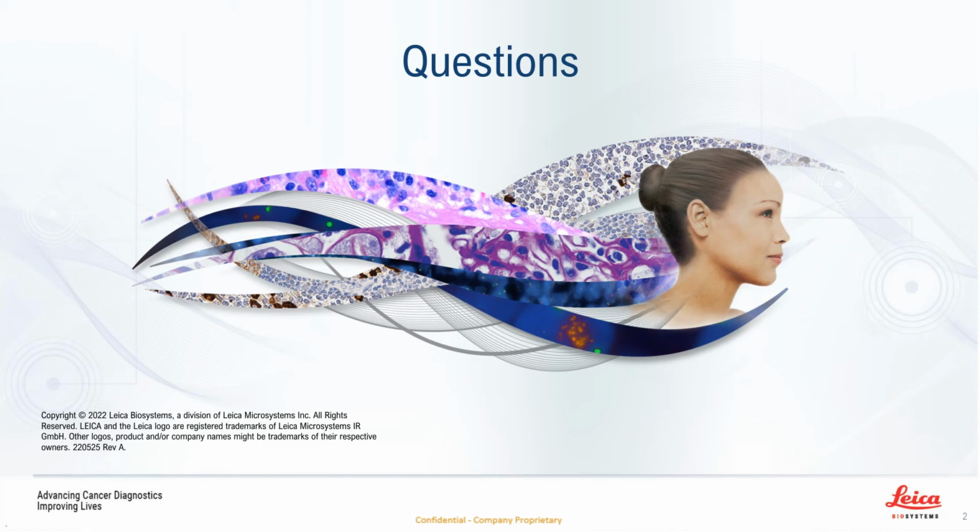And then the second would be, when you get somebody in or when you're looking at a demonstration of these units, make sure you're scanning your own slides and samples that are representative of your lab output and your typical usage or typical slides that you would create. It's never any harm to throw in a worst of worst type preparation to see how the scanner can cope with the worst type of slide that maybe comes out of your lab. But I think have standard ones and test the scanner with your own samples.